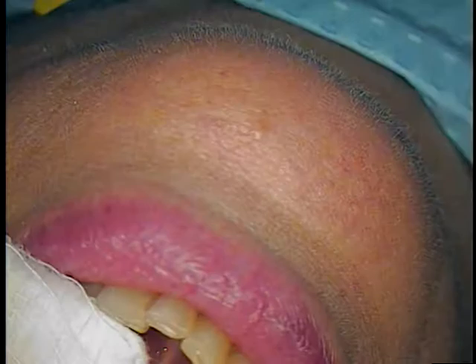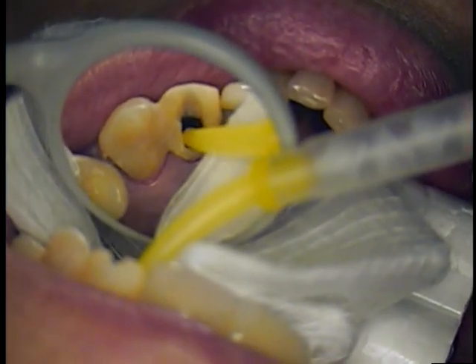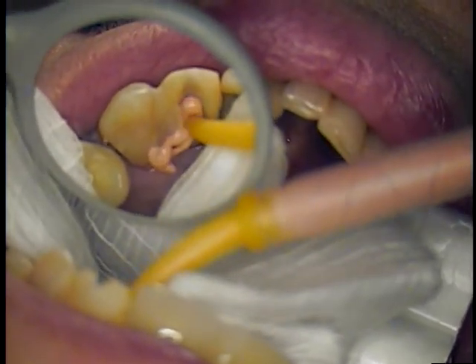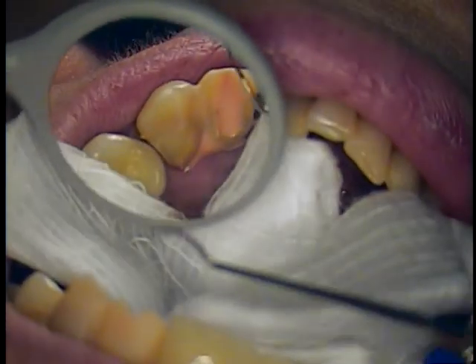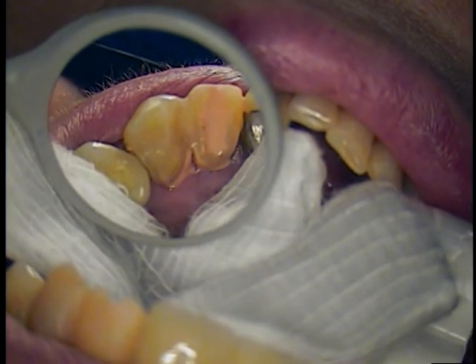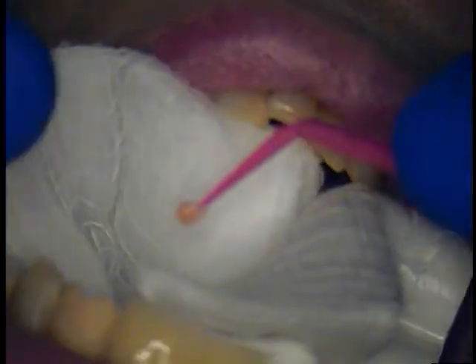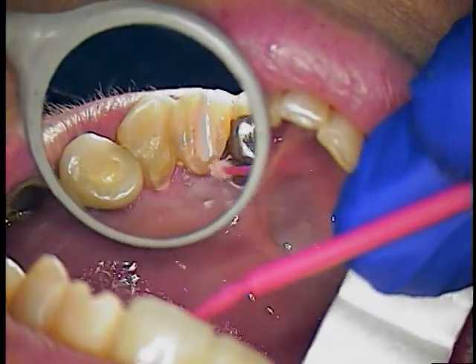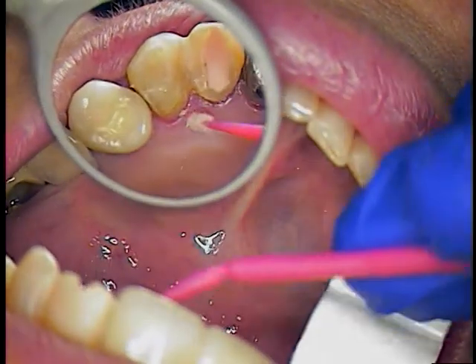Now I'm going to use a material called Extra Fast NDS from GC America, and it just sets very quickly. And we're just going to put some on the top of this, that's all. This is just a temporary. Wipe that. Okay, we'll let that set. Take a micro brush. And this we can actually watch set before she leaves. And we might even put a little bonding on the edge just so that it doesn't become a problem. I'm going to wait for this to set, though.